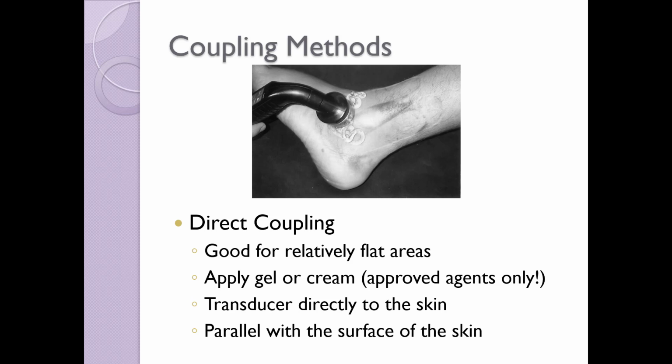Too much pressure decreases the amount of energy transferred to the tissues by scraping off the transmission medium, and the pressure may cause the patient discomfort. I would encourage you to keep the ultrasound transmission gel bottle available to add more transmission gel during the treatment. Many clinicians like to scoop the gel as it moves out of the treatment parameters, which then widens the treatment area and decreases our effectiveness of ultrasound.